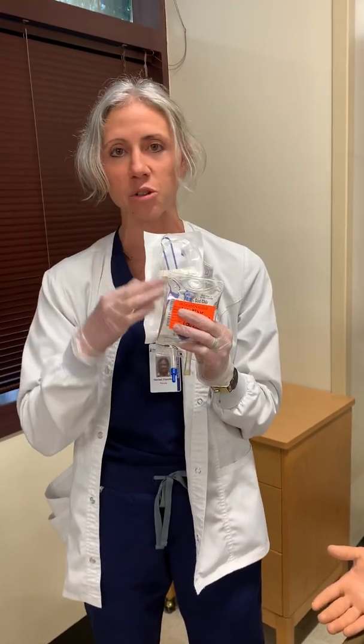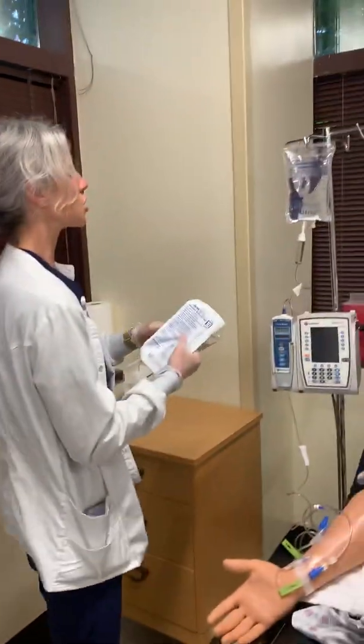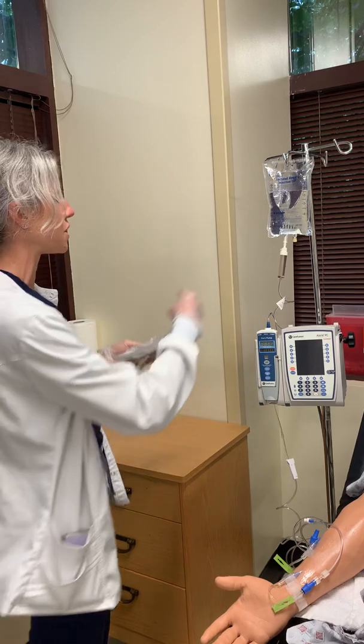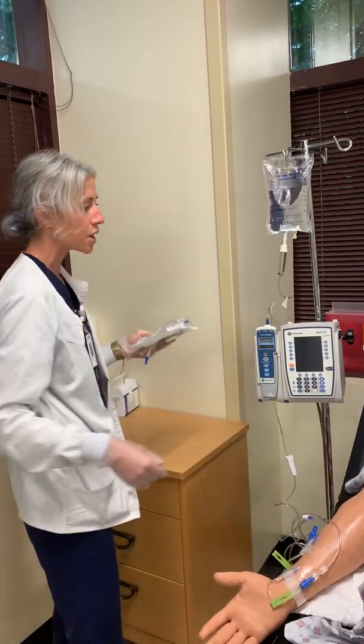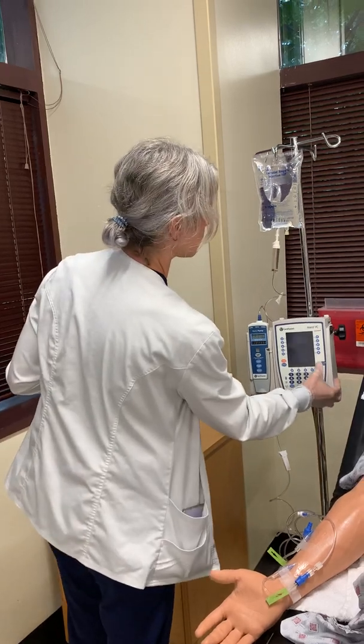You know what I think is always the easiest way, because you're going to see one of these nice little blue things in there. Sometimes they may be different colors, but they're almost always blue. But just make sure, because when they're putting the supplies in there, sometimes they're not in the right spot. And like I said, it's awful to get in the room and not have the right thing. So this tubing looks very, very different than this tubing. So just make sure. Now, I'm going to go ahead and turn my pump on.